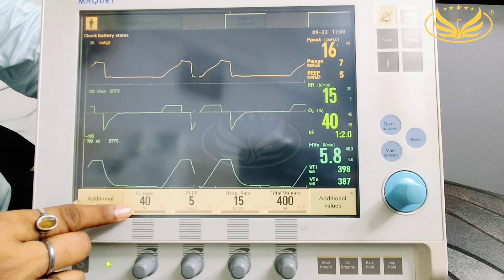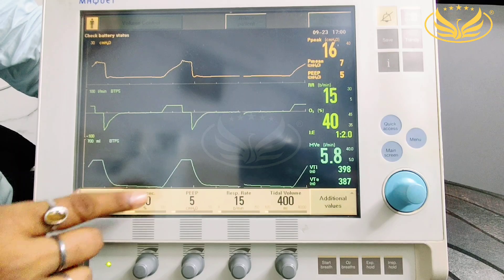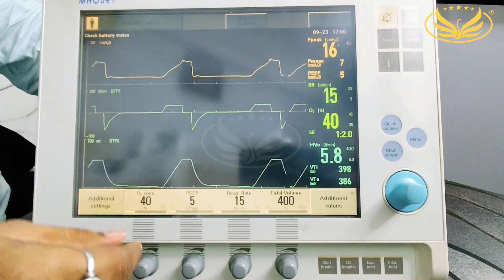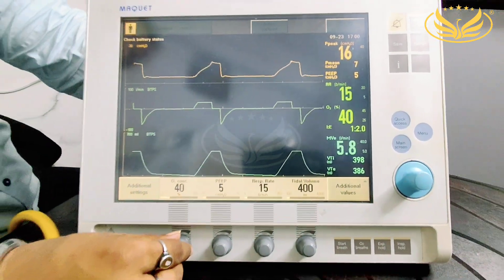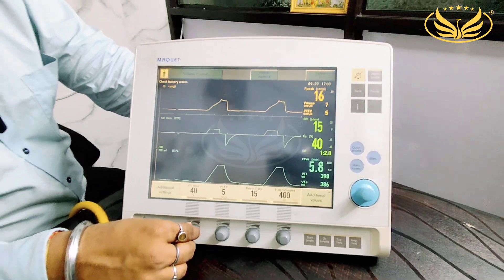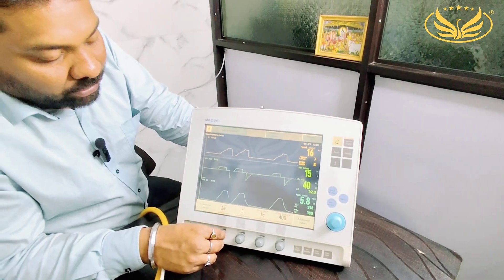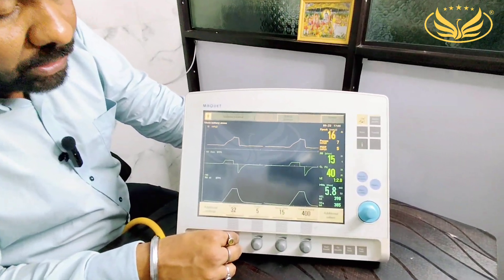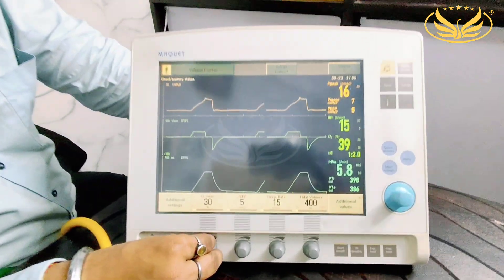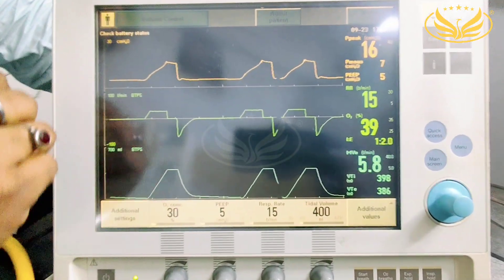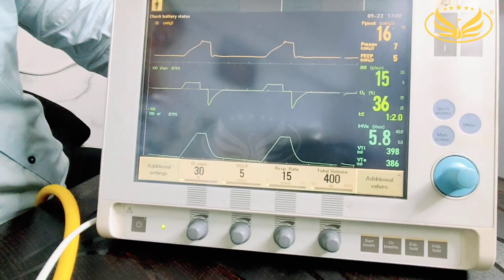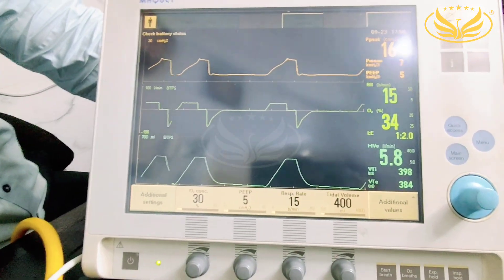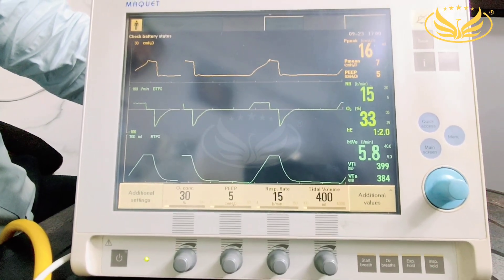We have kept FiO2 at 40%, so 40% is getting delivered. Suppose if you want to reduce the O2 level — let's say to 30% — the moment you change to 30, the O2 concentration starts getting reduced.